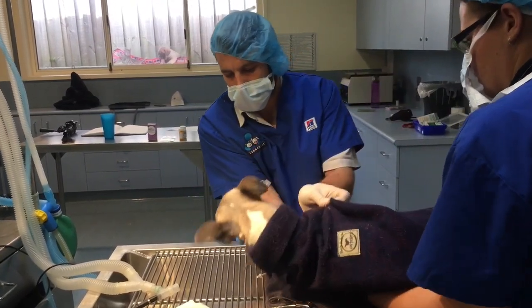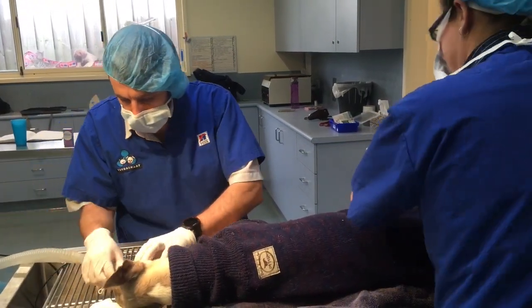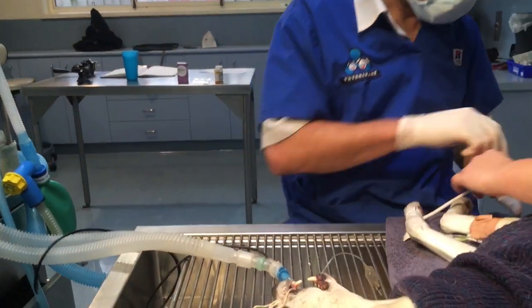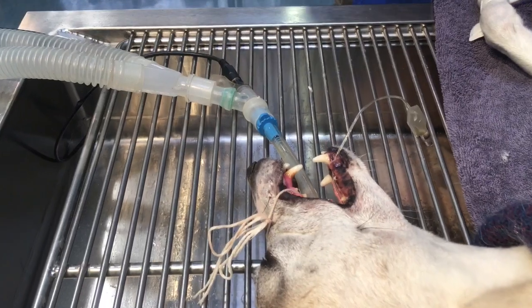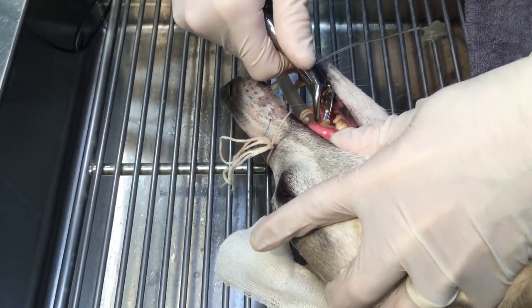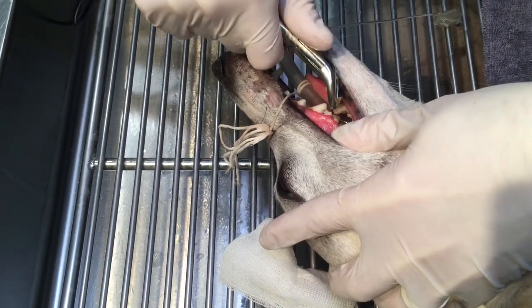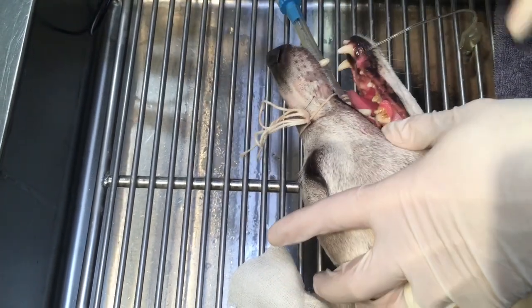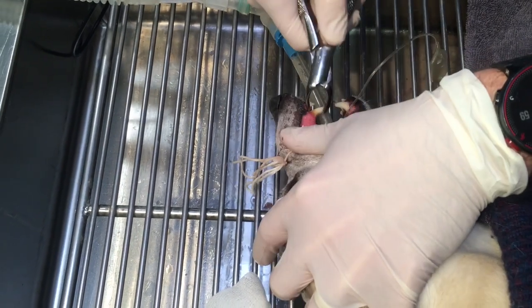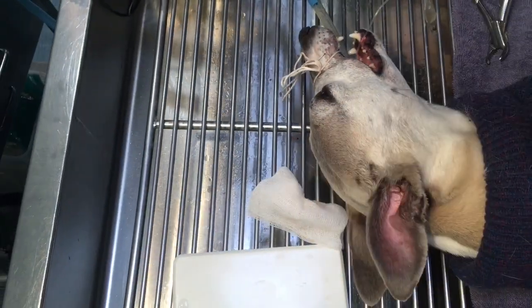Legs under on three — one, two, three. There you go, little Rosie. Watch the cranial trauma there. Cracking onto the other side. You can see we've got fairly similar sorts of signs on this side too. Clip that all off there. Now I go in there and start some scaling.